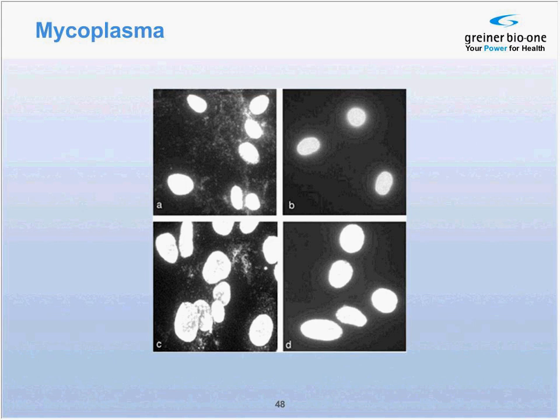Mycoplasma contaminated cell lines can be identified by DAPI staining. DAPI is a DNA staining fluorochrome that is usually used to stain cell nuclei, shown here on the right. And the stain pattern on the left is a hint for Mycoplasma contamination. So instead of the DAPI staining only appearing with the nuclei, it would appear as if it would stain the cytoplasm.